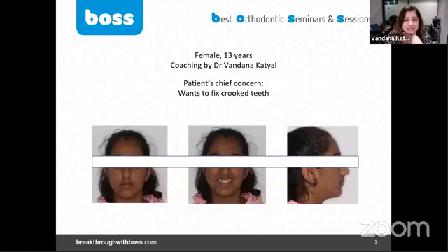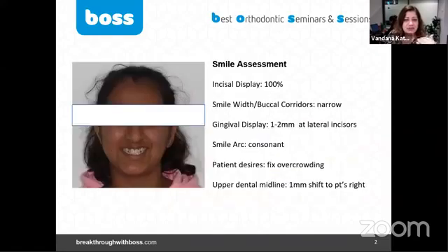You can see a very well-done summary — beautiful frontal shot, very symmetrical, ears projecting equally to both sides. The upper midline is slightly off to the right. I trust this photo a lot because the ears are quite similar when they project, so it's taken quite symmetrically with eyes looking at the horizon, which is natural head position. There are slightly narrow buccal corridors and not much gingival display.